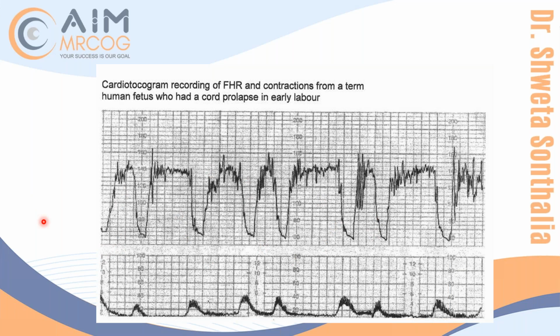Yeah, I totally agree with you. My nurse will totally agree with you. Even 2 years back, I would agree with you, but now no more. Ma'am, this is late deceleration. Even I will say that there is a mixing of early as well as late. So is there anything like early and late? No, so this will be called late, mostly. Variable deceleration. Very good.